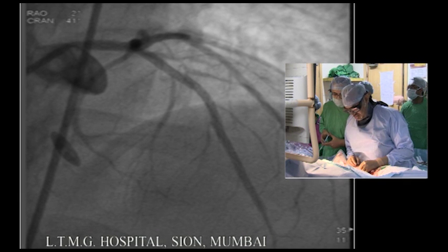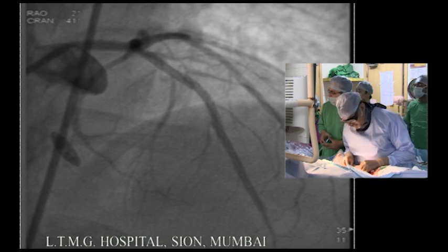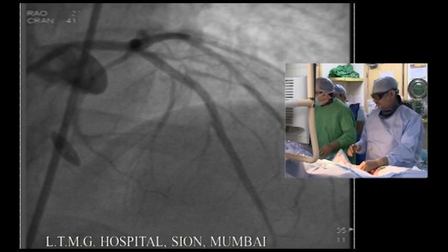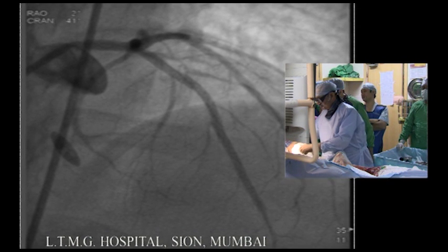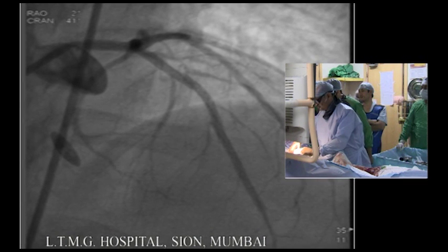Yeah, there is a third dimension to coronary anatomy which is not seen on angiogram. So you save on the contrast and use it. Personally, I am in favor of IVUS because a monorail pullback is very rapid. You don't use any contrast. OCT gives you too much detail, which you cannot use. So I vote for IVUS in this case. I'm not seeking perfection. I'm seeking a good outcome.